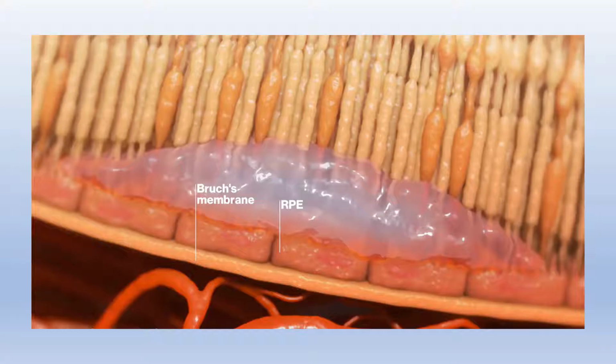The understanding of Müller cells' dysfunction in diabetic macular edema has granted a better understanding of OCT findings in this disorder. In detail, we have a better comprehension of three important OCT findings. First, in diabetic macular edema, the intraretinal fluid may physically separate and displace Müller cells' processes, which are thus visible on OCT images as hyperreflective columnar elements.